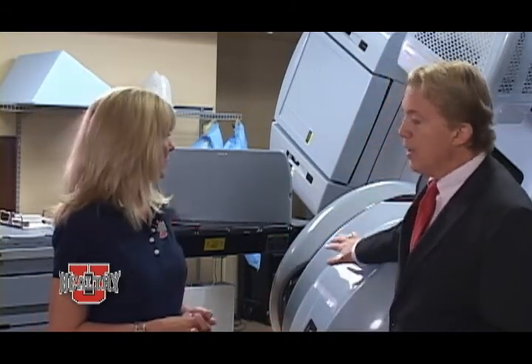Okay. Is breast brachytherapy a treatment for women who have had breast augmentation? Women with breast augmentations are a particular problem, because when we treat them with this big machine here, the dose wraps around the foreign body, which is the silicone implant, and it causes a rubber band-like hardening of the implant because scar tissue wraps around the implant.